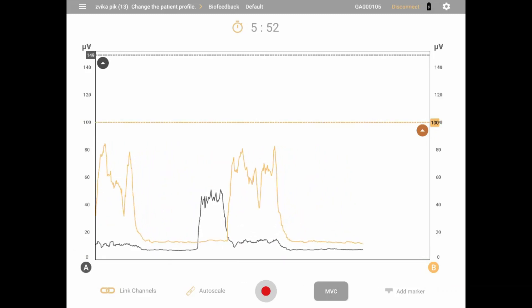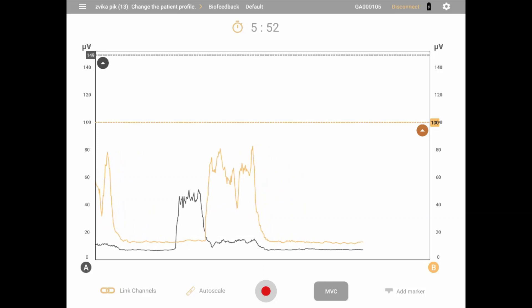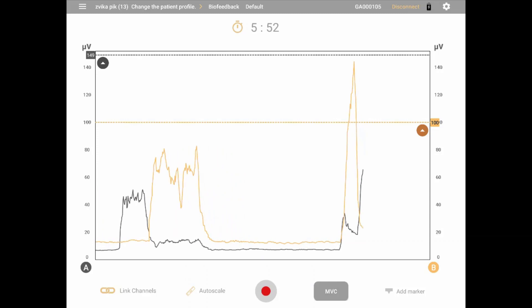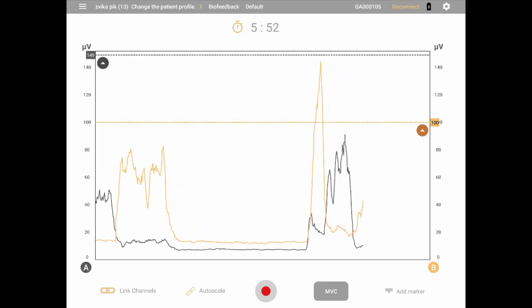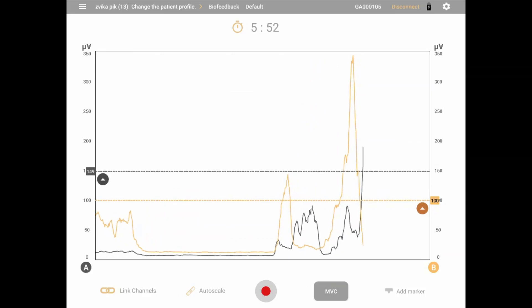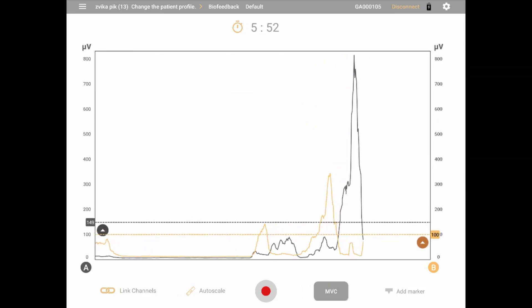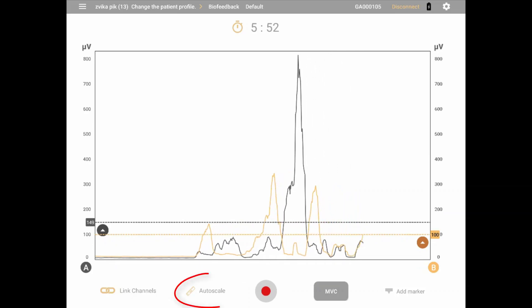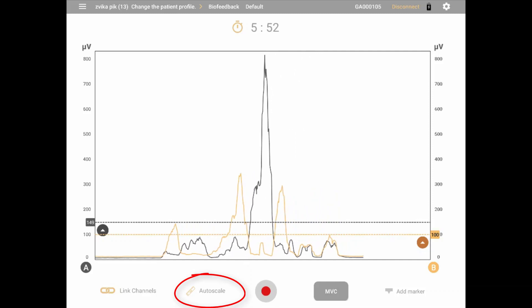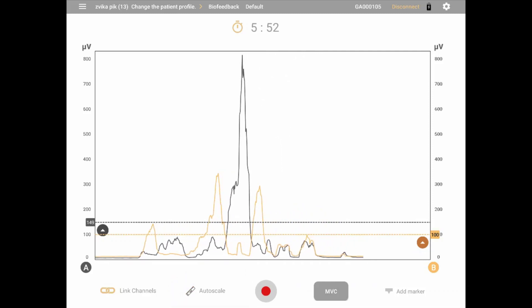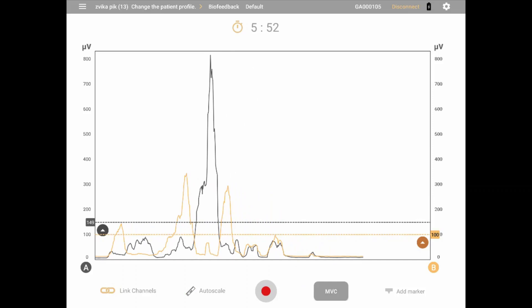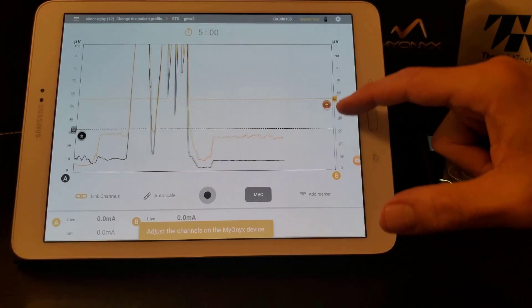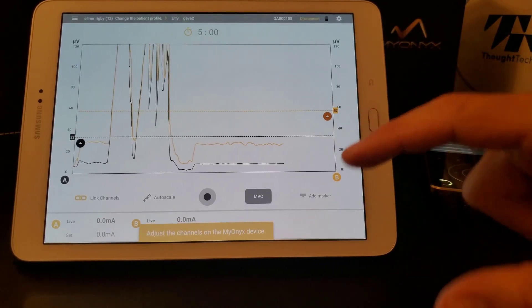Several other options are available to fit the view to the user's needs. By default, y-axes are auto-scaled and both channels are linked to each other, meaning the scales will zoom in and out automatically to show the entire range of amplitudes reached. To adjust the zoom manually, first unselect auto-scale by clicking the auto-scale button on the bottom left of the screen. The button will turn from gold to gray. You may now zoom in and out by pinch to zoom or by drag and dropping up and down on the scales themselves.